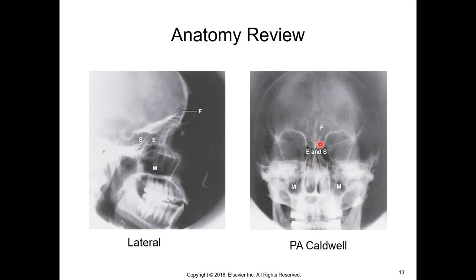Generally, you mostly see ethmoid. It's kind of being generous saying you can see your sphenoidal, but you can't because it's superimposed by the ethmoid sinuses. And then here are your maxillary. So when you're looking at a radiograph, the sinuses generally are filled with air, so they're going to look darker on a radiograph. Wherever you see areas where there's darkness, there's generally air. See it going down into the throat region, your trachea here. Here you've got air, and then back here, you can see the mastoid air cells.